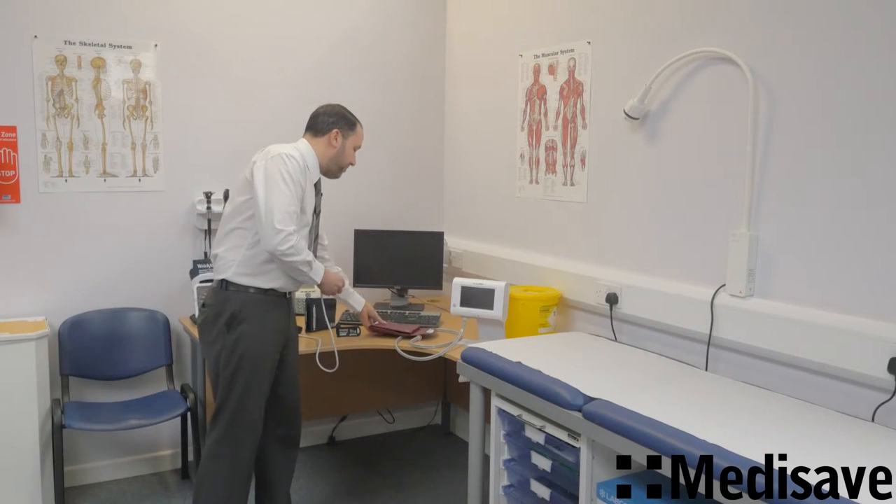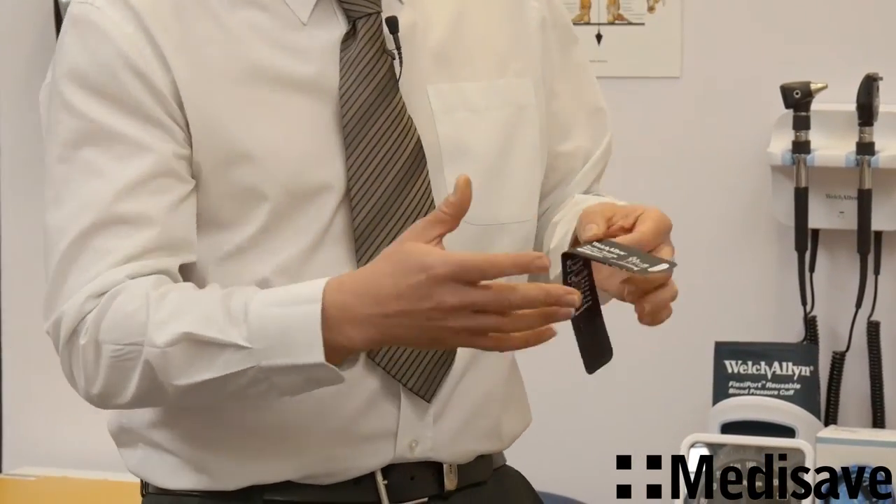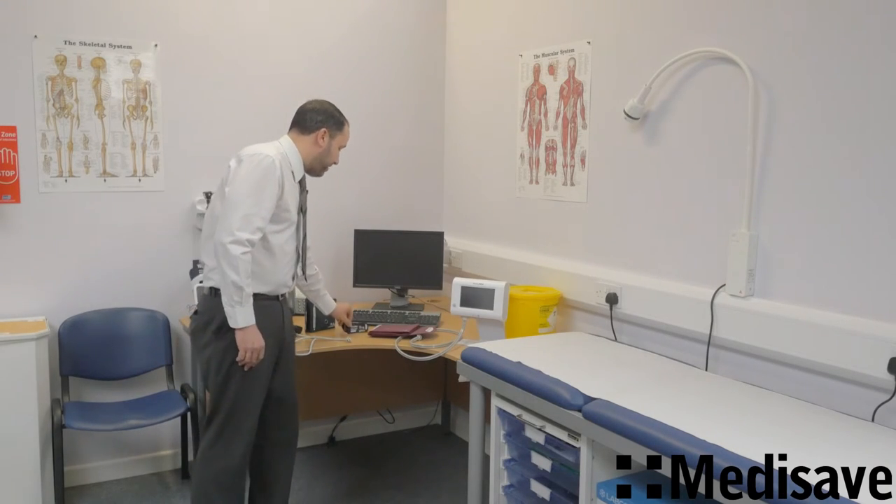They come in a variety of different sizes. This is the small infant — it's absolutely minuscule. So if you wanted a range of cuffs, it's very simple — you can have three cuffs, very lightweight, just folded up in a bag.